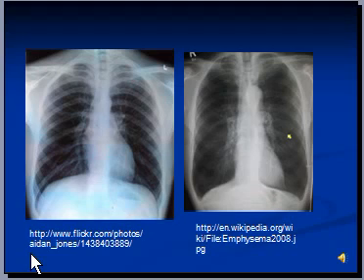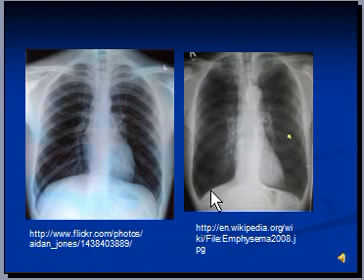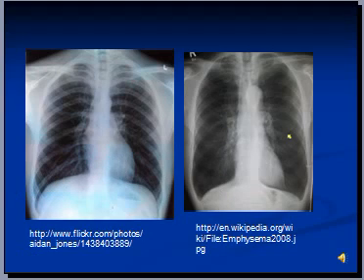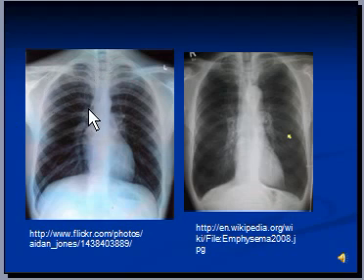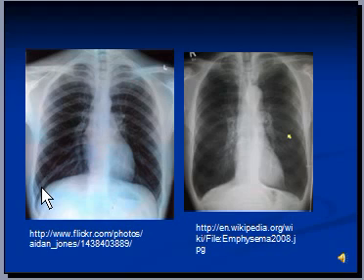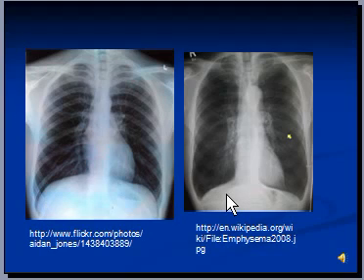The radiologic features of emphysema include hyperinflated lungs. The rule of thumb is that lung tissue should not be visible beyond the seventh anterior rib. Counting from the first posterior rib continuing anteriorly: first, second, third, fourth, fifth, sixth, and seventh anterior rib. In the normal x-ray the lung tissue is not visible beyond the seventh anterior rib, whereas in the emphysematous x-ray the lung tissue is visible well beyond it — this is the first radiologic feature of emphysema.